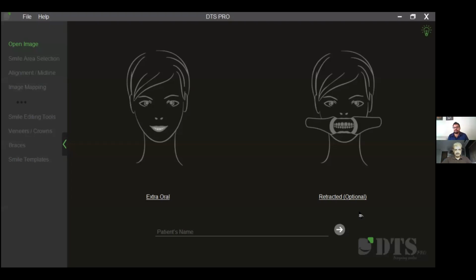That sort of lit a bulb in our mind, saying that there should be something which is easy to use by practicing dentists, orthodontists in particular, to show the patients, convince them, and motivate them, even before they say yes to treatment.